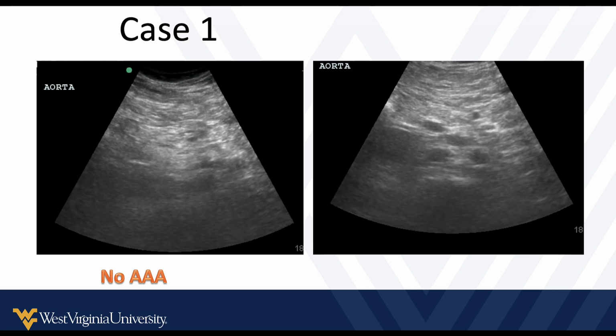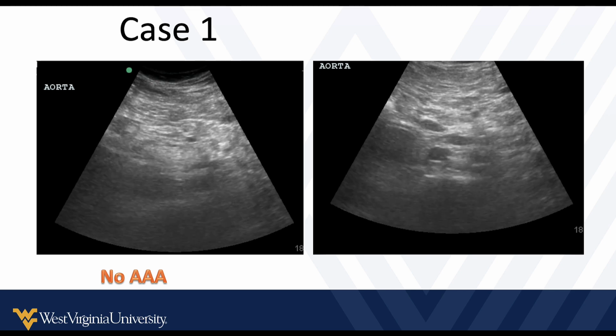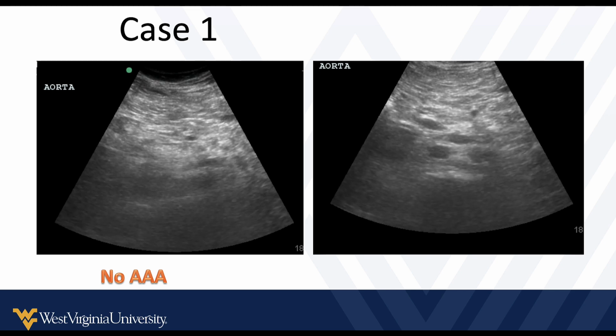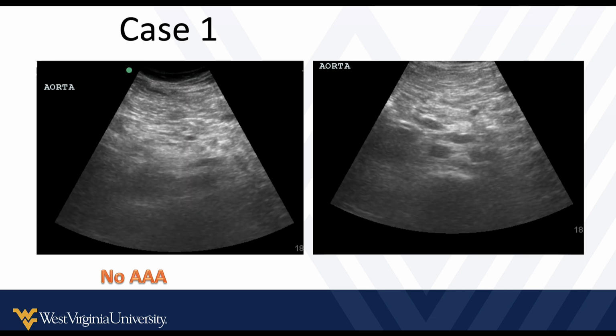Say, hypothetically, if you find findings of an abdominal aortic aneurysm in a patient that has symptoms that are consistent with rupture. I think that's important to point out and understand how this can affect and improve your decision making.